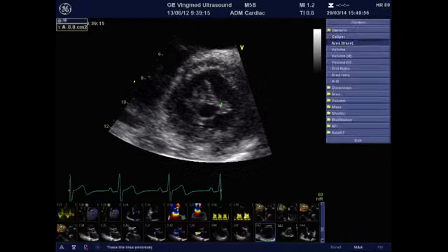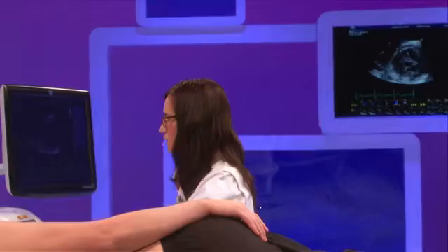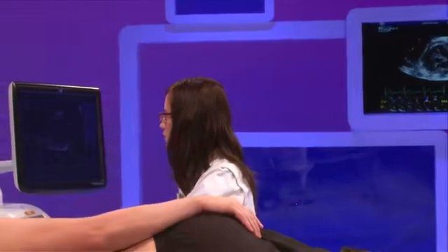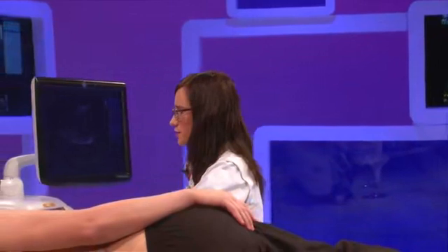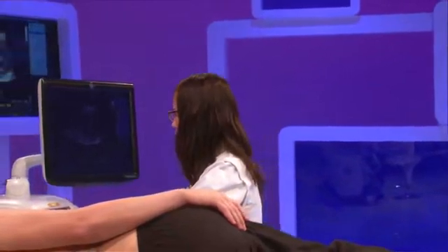You'll start from the commissure and go to the black and white interface, going clearly around the leaflet borders up to the first commissure, and you see here that I have a mitral valve area measured in 2D planimetry of 1.3 centimeters square, which suggests a significant mitral valve stenosis.